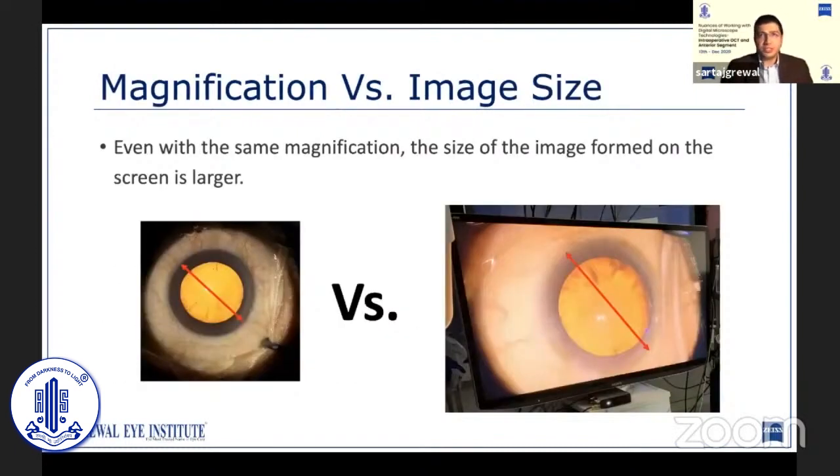When frequently switching between the Lumera 700 and Artevo, the magnification level is higher. But even at the same magnification levels across both platforms, what you see on a larger television — the image formed on screen is bigger. This allows you to see a lot more detail and operate a lot more comfortably.